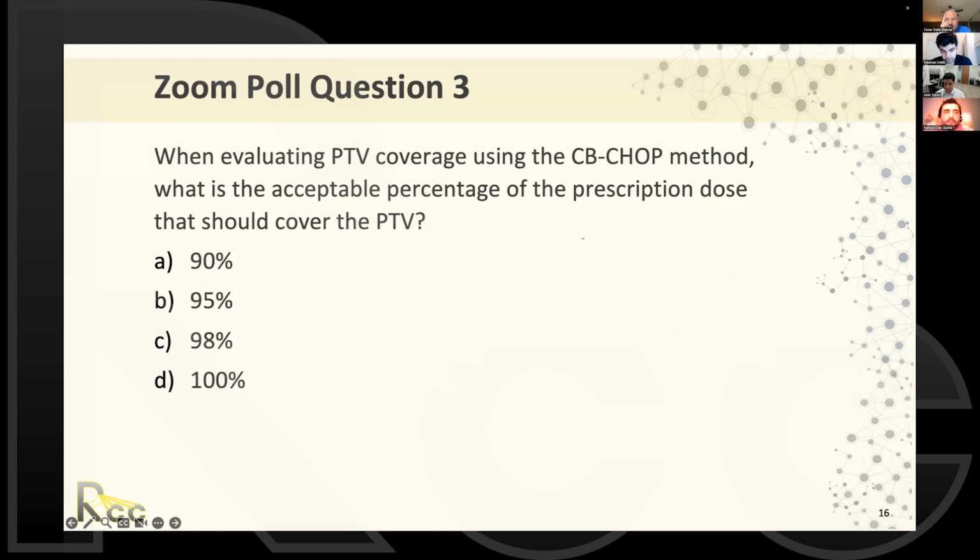So I have one question from Anthony Paredes. For IMRT and VMAT, what's considered hotspots and cold spots? If you wait after this question, we'll talk about the hotspots. So not to give away the answer yet.